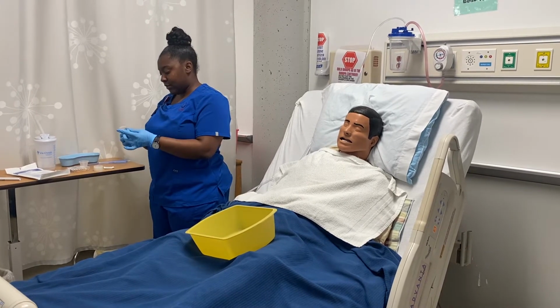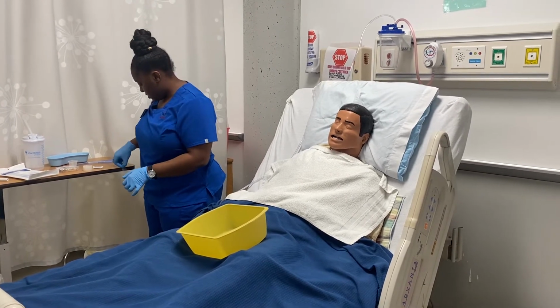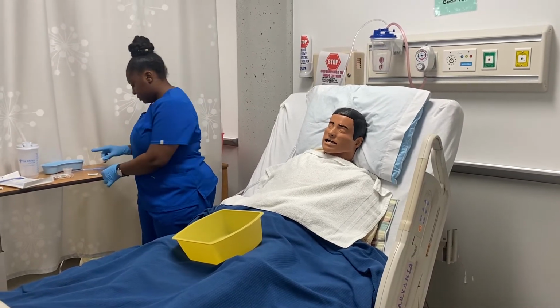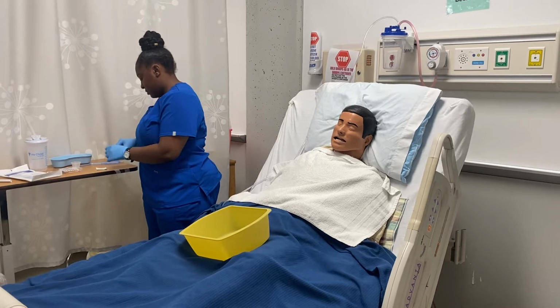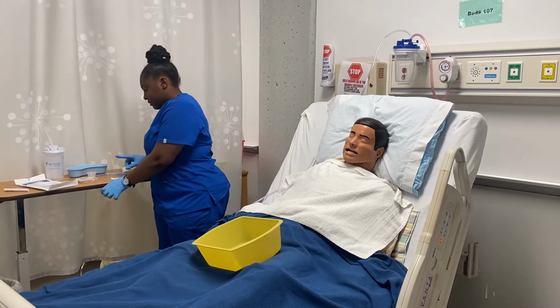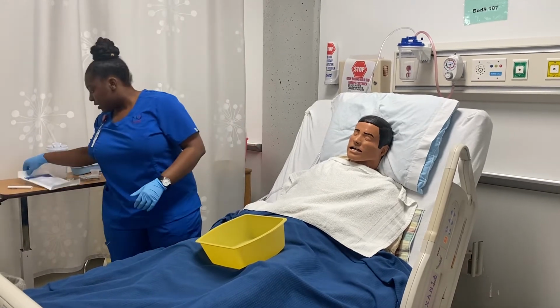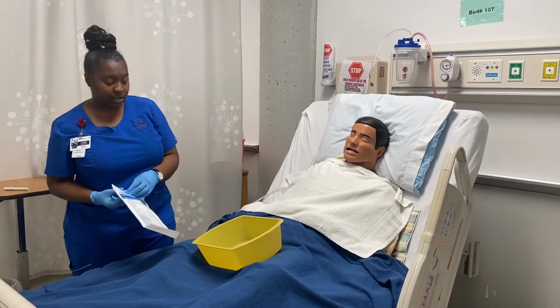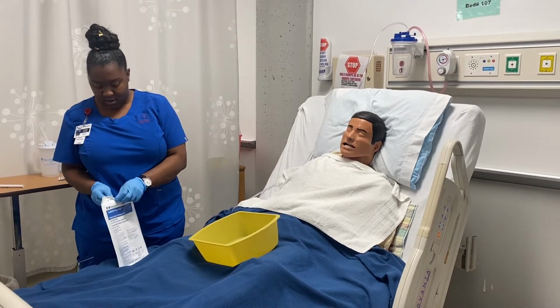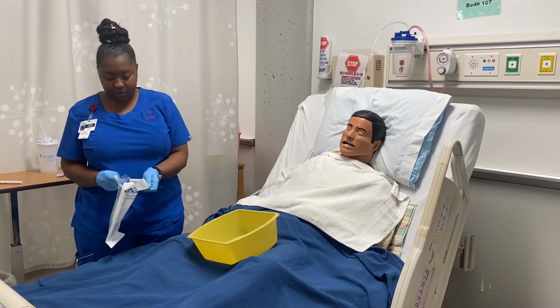Split this one in half for the nose. Okay, perfect. Then I'm opening my NG tube packaging. If you feel sick at any point, let me know.